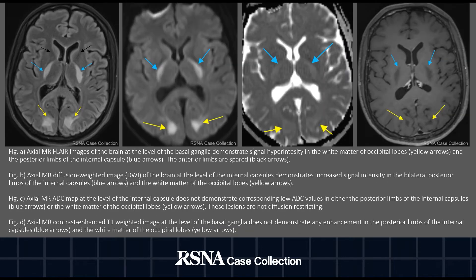The patient then underwent an MRI of his brain with and without contrast to evaluate his CT findings. Figure A on the left is an axial FLAIR image of the brain at the level of the basal ganglia. It demonstrated signal hyperintensity of the subcortical white matter in the occipital lobes and the bilateral posterior limbs of the internal capsules. Notice the sparing of the anterior limbs of the internal capsules bilaterally. Figures B and C are the diffusion-weighted images and the corresponding ADC map at that level. Although the lesions demonstrate a bright signal on the DWI images, they do not have a corresponding dark signal on the ADC map and hence are not diffusion-restricting. Figure D is a contrast-enhanced T1 image at that level, which does not demonstrate any enhancement of these lesions. The cerebellar white matter lesions had similar imaging characteristics.